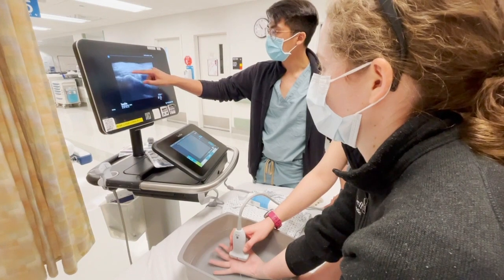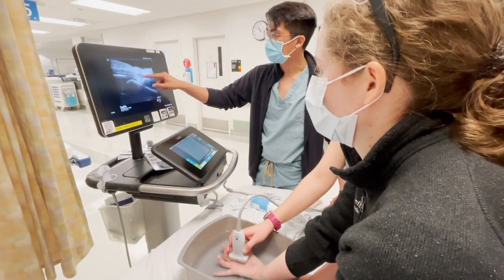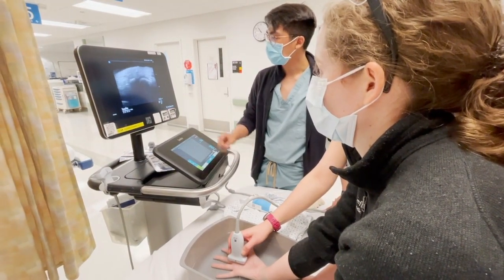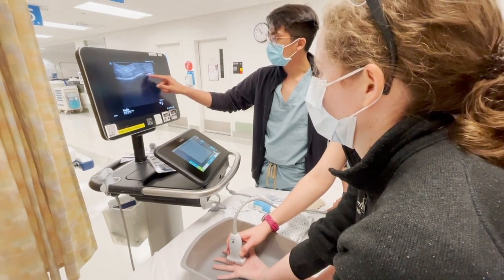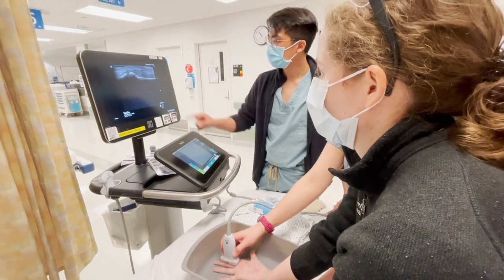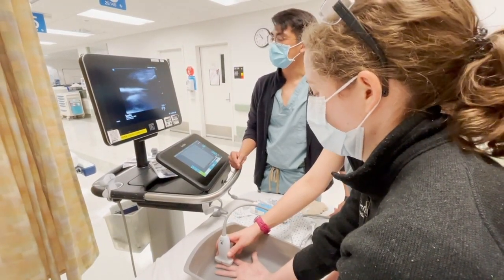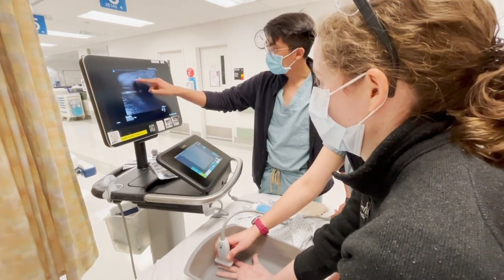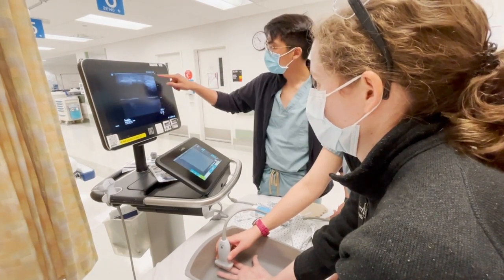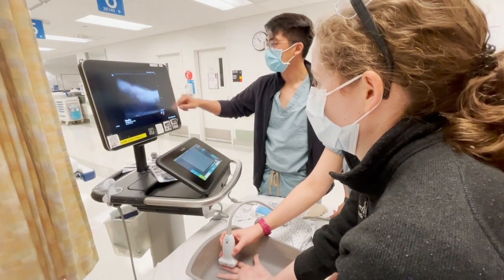In long axis view, starting around the metacarpals, we can see the flexor tendon — as the patient flexes their finger, we can see the flexor tendons slide. As we move more distally, we'll see the MCP joint come into place, then the PIP joint, and even more distally the DIP joint. As the patient flexes their finger, we can see the flexor tendons slide back and forth.